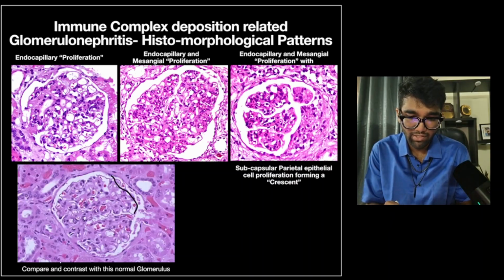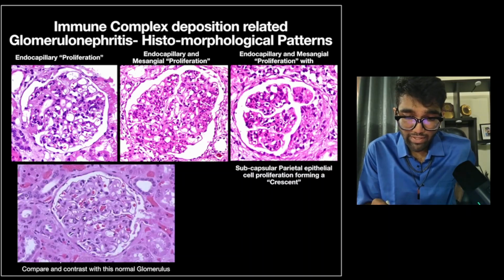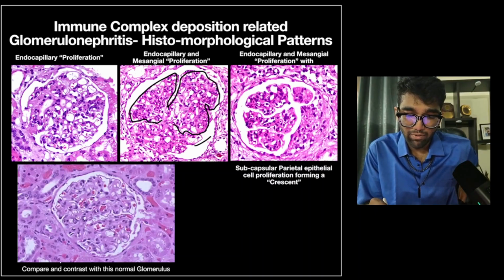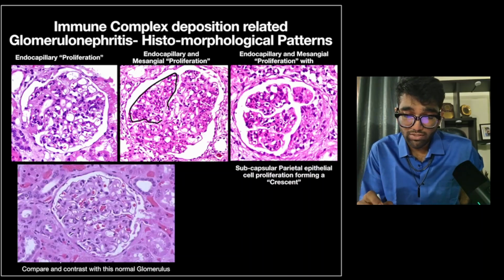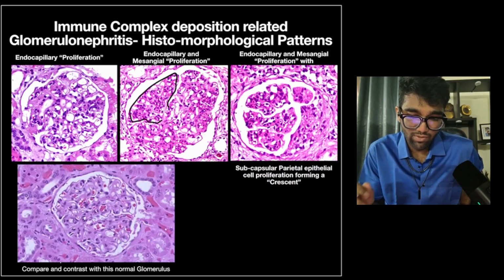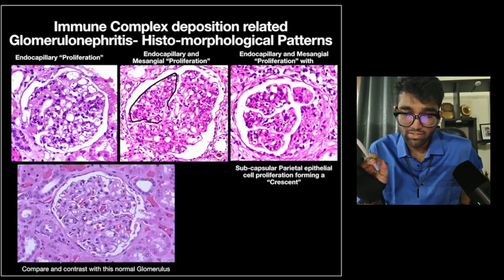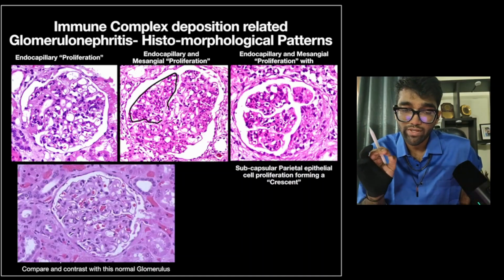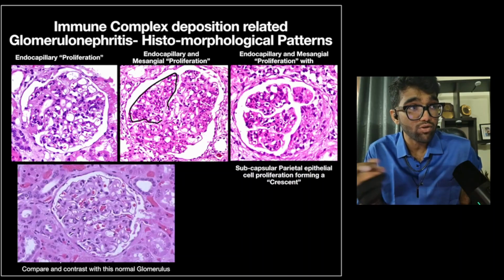Okay, whereas in this particular capillary glomerulus, I would find it very difficult to differentiate between capillary tufts. Here I can quite easily say this is one capillary tuft, this is another capillary tuft. Okay, this is the third capillary tuft. So that lobulation, pronounced lobulation with a paucity of RBCs within the glomerulus, with a subjective assessment of an increase in number of cells, is quite a clear indication that that glomerulus is showing proliferation. And once you know that the capillaries don't have RBCs and most of them are collapsed, there is endocapillary proliferation.